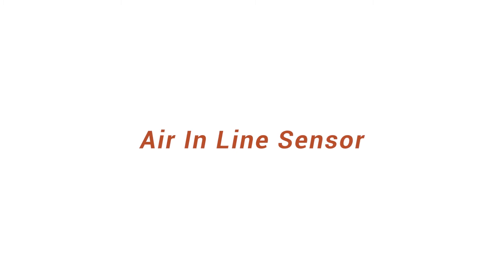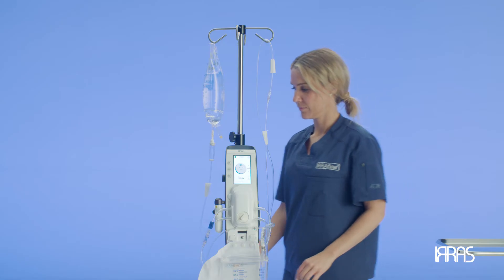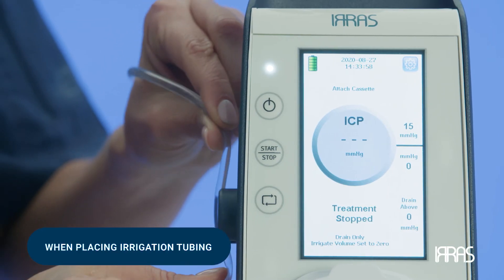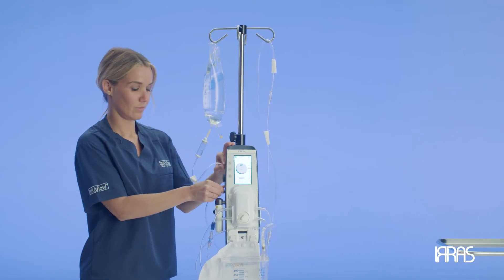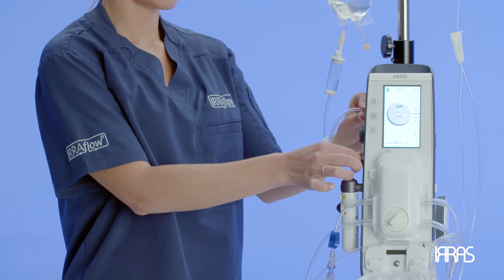Air-in-line sensor. Now that the cassette is calibrated, let's focus on placing the irrigation tubing into the air-in-line sensor. When placing the irrigation tubing into the sensor, make sure that the tubing is fully inserted. We are placing the tubing into the air-in-line sensor to ensure that no sizeable air bubbles are introduced into the system via the IV bag.